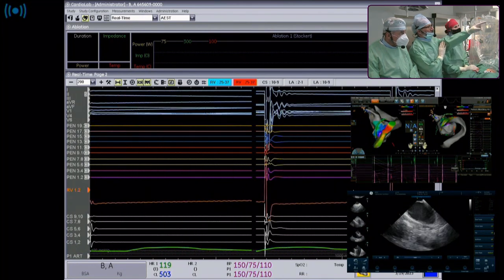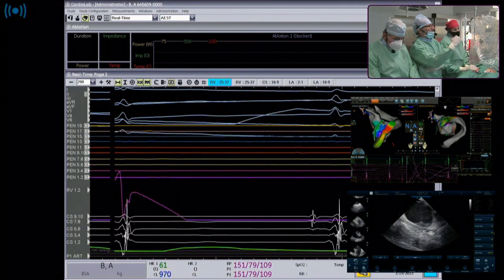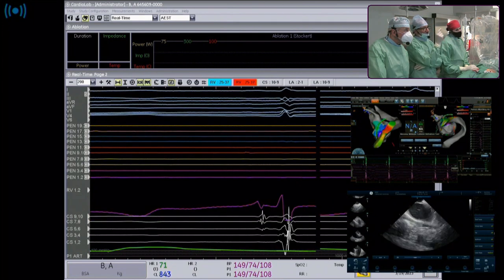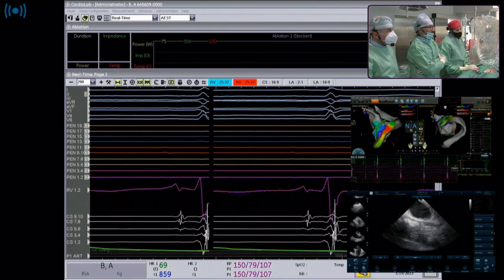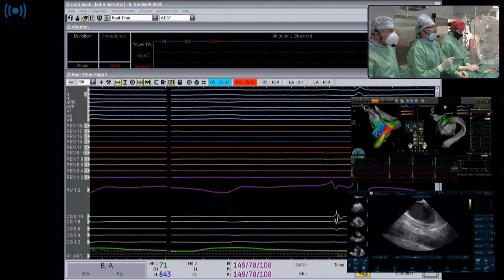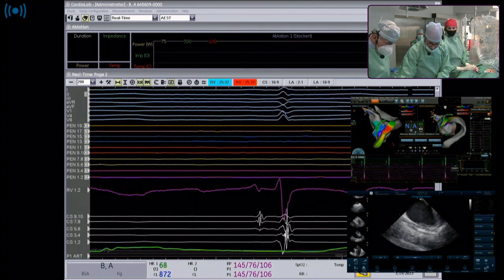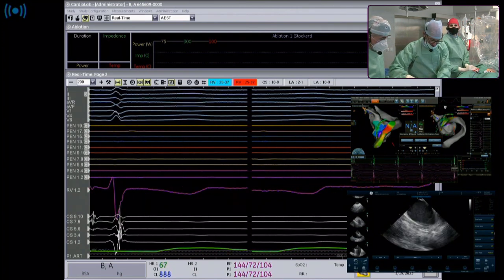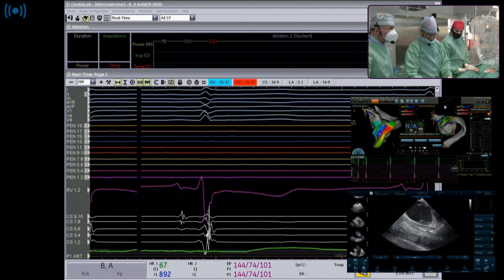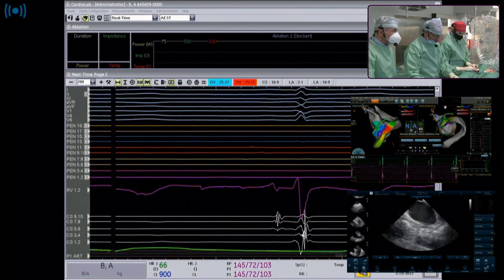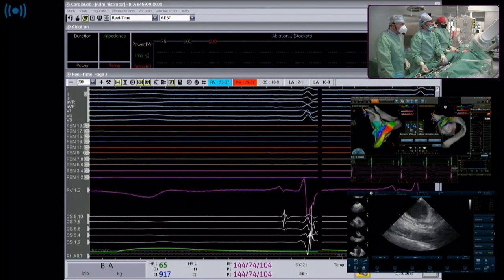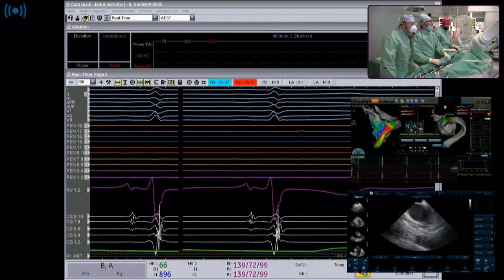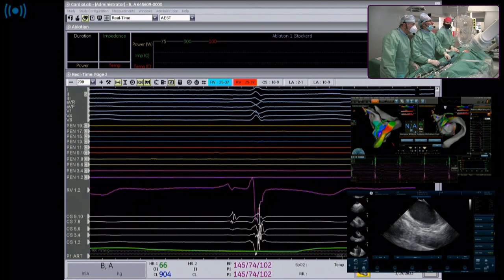We will leave Miguel struggling with this small vein and switch to the other case at the normal hospital. The problem is we need to make sure we don't lose that wire - the Agilis is not stable, the LIMA is not stable.